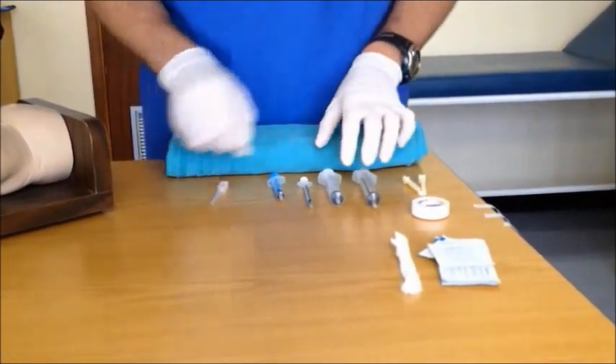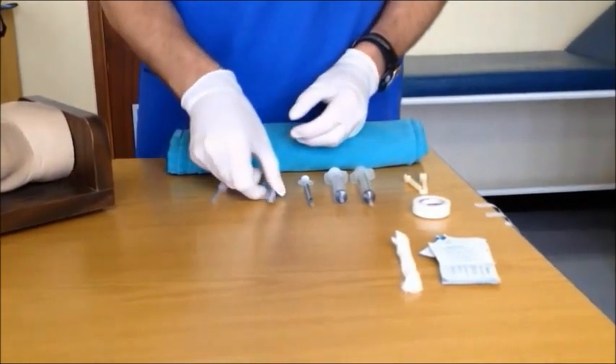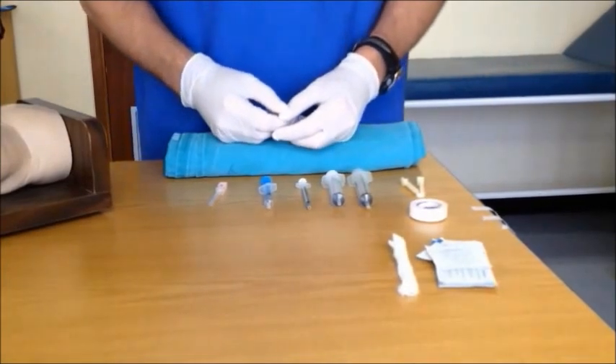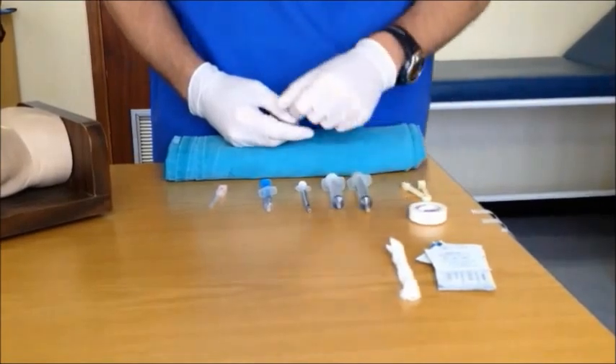You will also need a selection of syringes — 10ml syringes should be fine — and any drugs you require pre-drawn to the dose which is weight appropriate. Although there is no one excellent way to secure intraosseous access, we will show you one technique that uses an umbilical clamp, some tape and gauze.